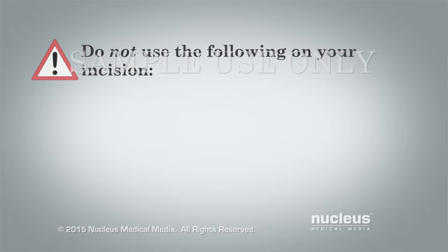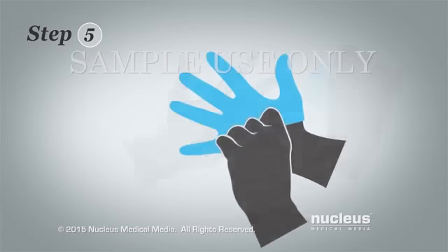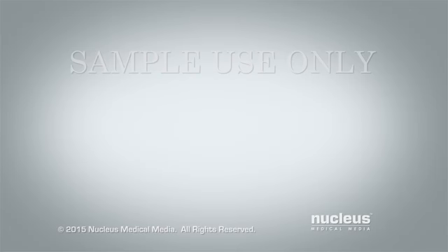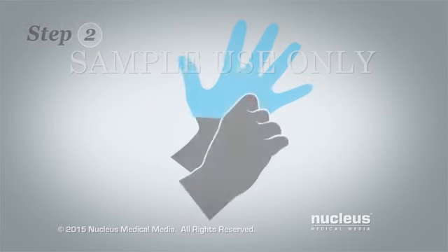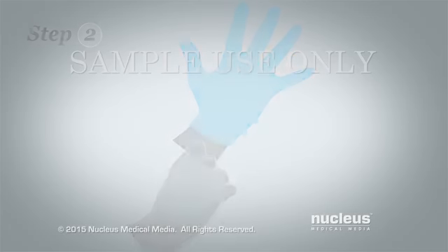Unless your healthcare provider says you should, do not use ointment, lotion, or powder on your incision. Step 5. Remove the disposable gloves and throw them away in the wastebasket. Apply new dressing. Step 1. Wash your hands with soap and water and dry them. Step 2. Put on a new pair of disposable gloves.